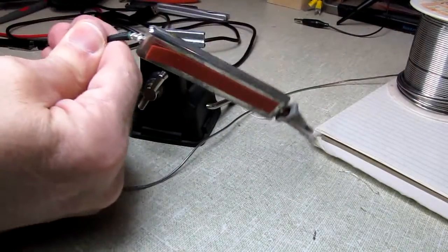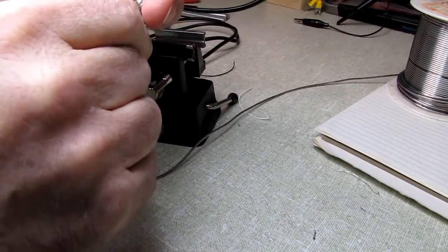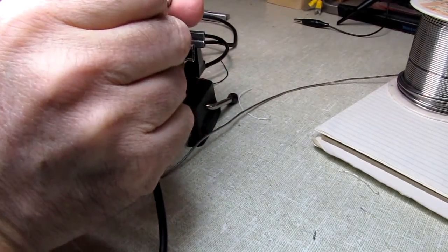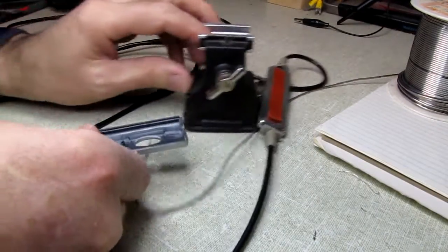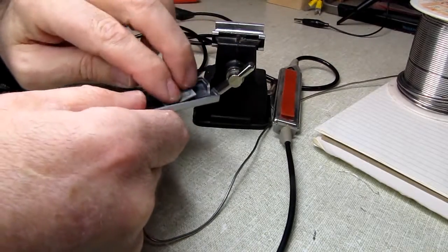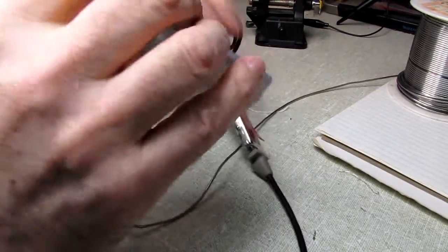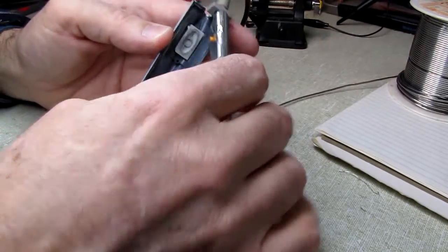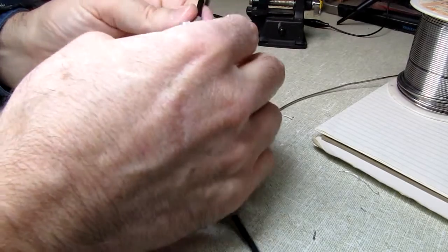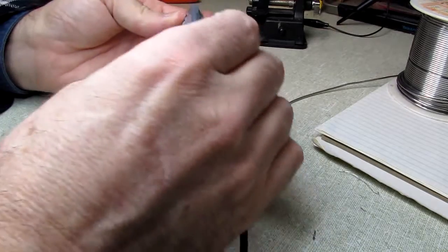We'll force the insulation back up where it belongs. There we go. Nice and cozy. Run this little ferrule up here, and let's see. I'll drop the little rubber push button back in. Get that guy out of the way. And let's see which way does... Oh, okay. That's got a little molded spot right there, so that comes up over the top. Oh, this is cracked. My goodness, it's seen some rough duty.